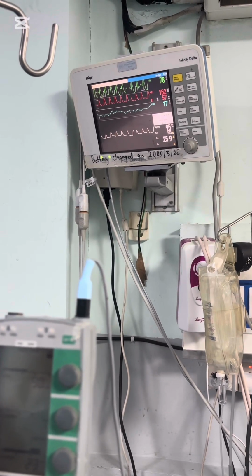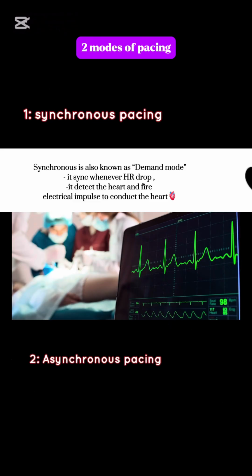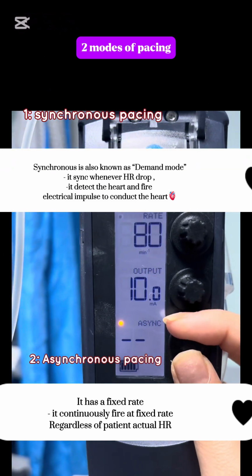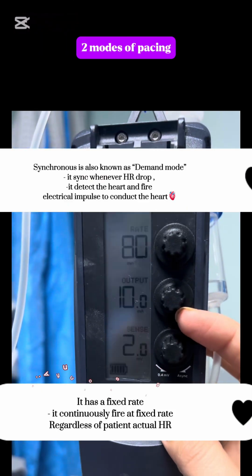Actually, there are two modes of pacing. One is synchronous and another is asynchronous. Synchronous is also known as demand mode. It syncs whenever the heart rate drops, it detects the heart and fires the electrical impulse to conduct the heart. And in asynchronous, there is a fixed rate. It continuously fires at the fixed rate regardless of the patient's actual rate.